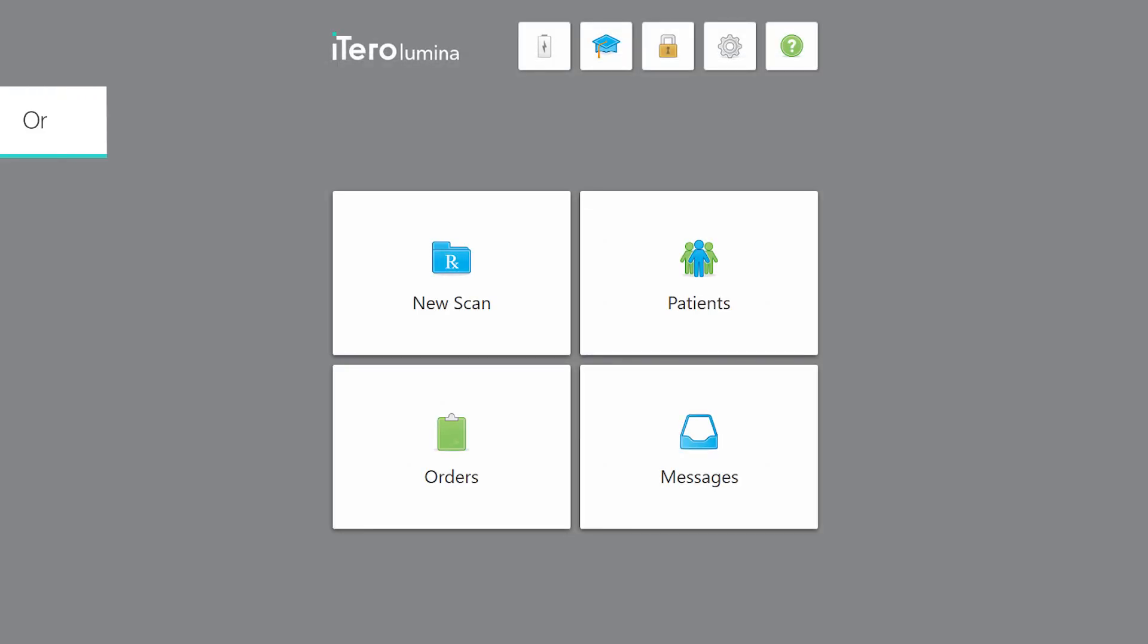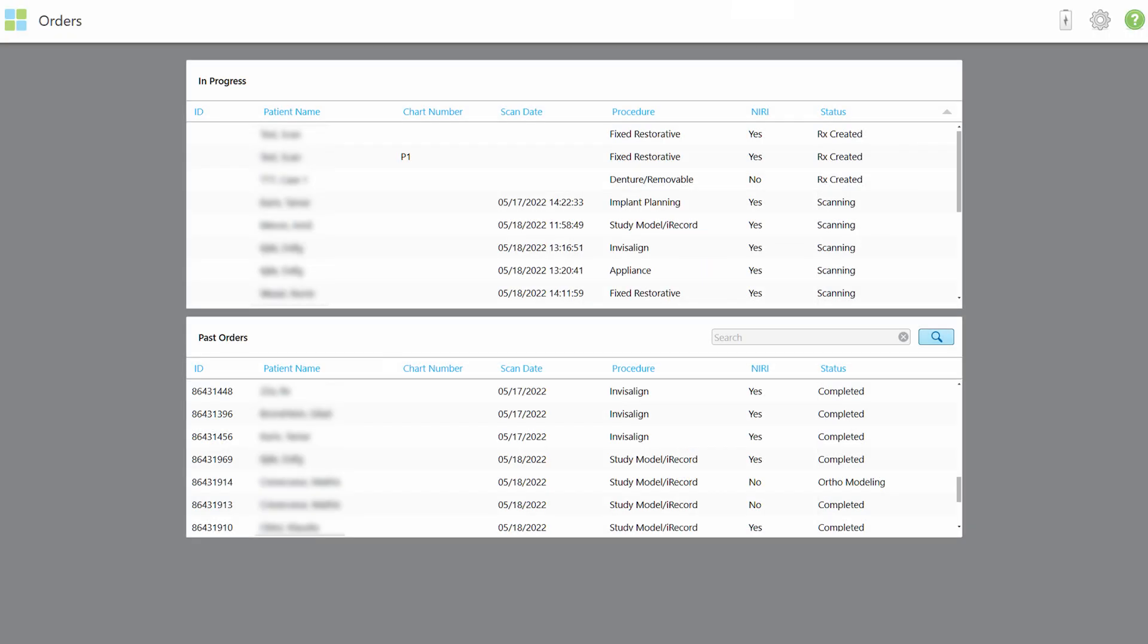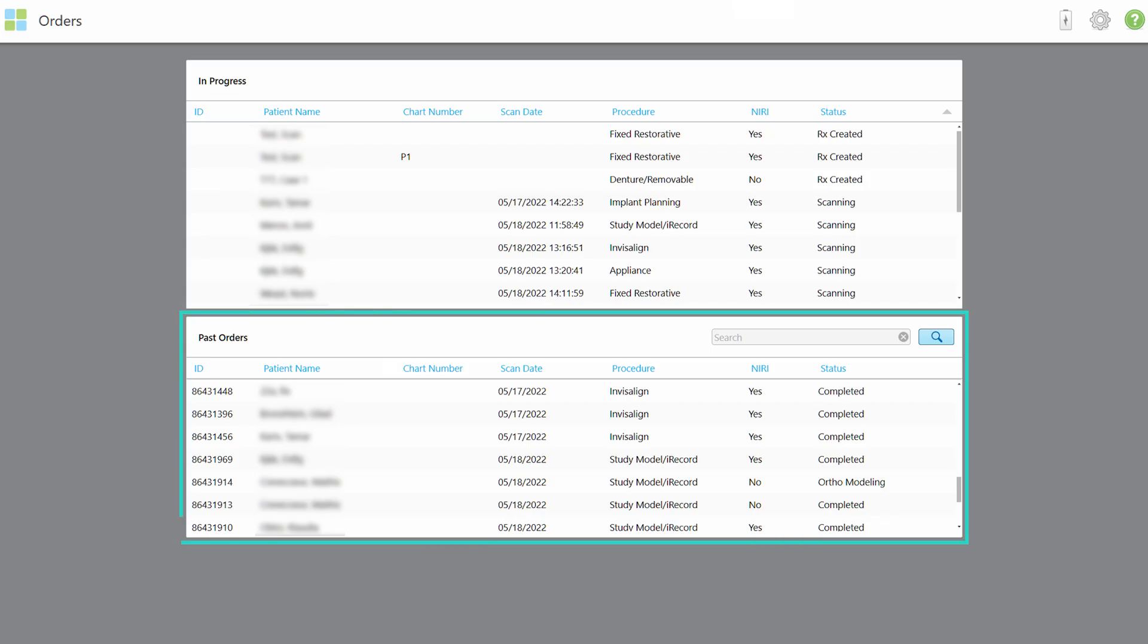Tap the Orders button to display a list of all your orders, including the unsubmitted orders you currently have. The Orders page has two panes. The upper pane is listing orders in progress. The lower pane is listing submitted orders.